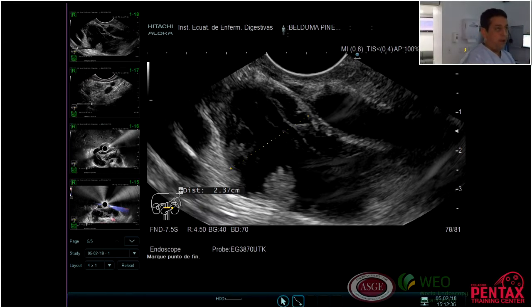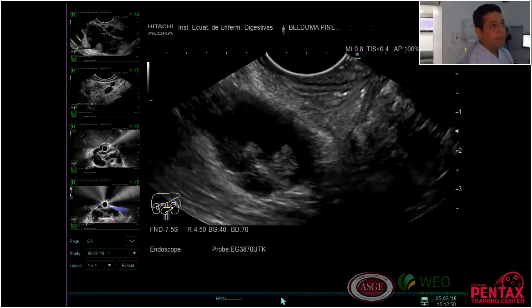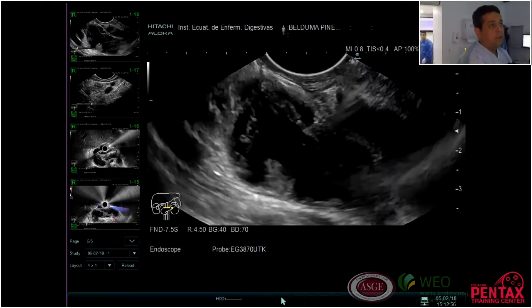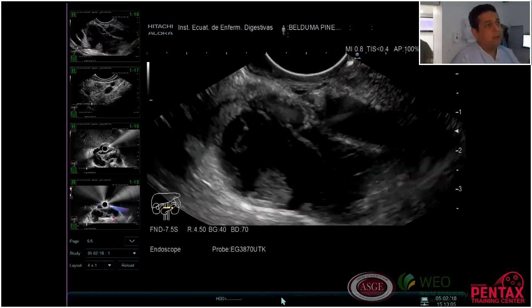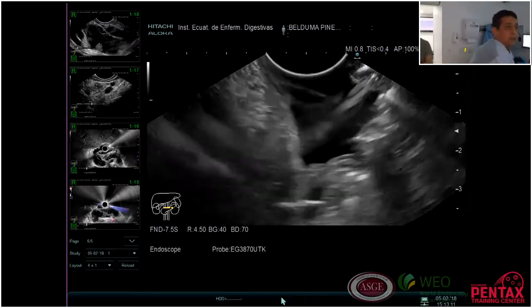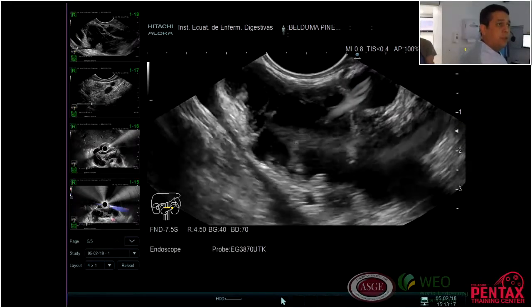We also have here some kind of nodule inside the main pancreatic duct, and if we arrive to confirm that this is IPMN, this is a malignant IPMN, okay? Even if this is a malignant IPMN, these patients have several characteristics that are very important to be analyzed, because probably these patients could be sent to surgery, to my opinion.